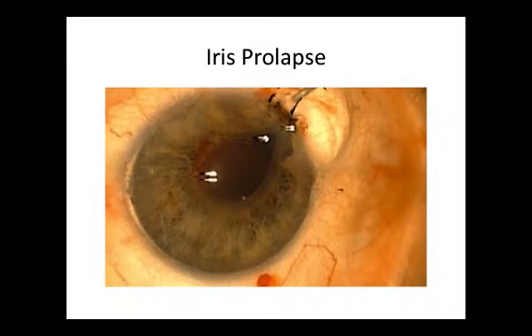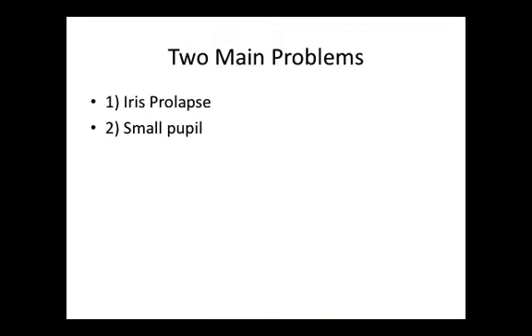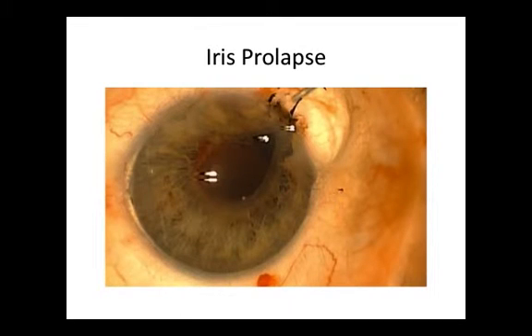In this case, after enlargement of the corneal section to facilitate removal of an IOL broken during the insertion process, iris prolapse has occurred. There are now two main problems: the iris is prolapsing, and the pupil is so small it is going to create difficulties for both the introduction and further positioning of the toric intraocular lens implant.